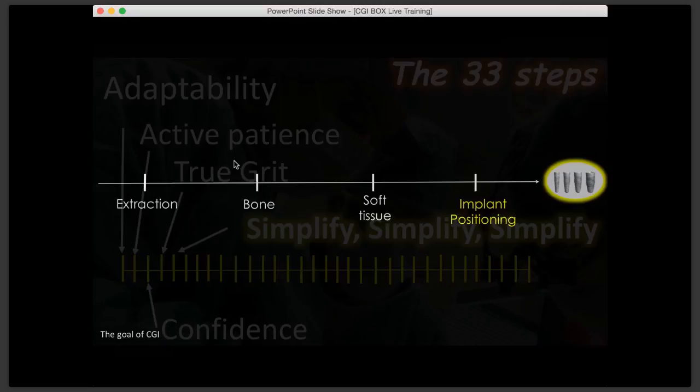Okay. Now, it so happens that the tube is critical, and here you see one example. What if you planned an implant in a position that looks great, and this is exactly where you want it, in between the teeth, in the right restorative position away from the buccal plate, but in order to place it in this position, because one of the teeth is malpositioned, your tube engages the tooth structure or the root?